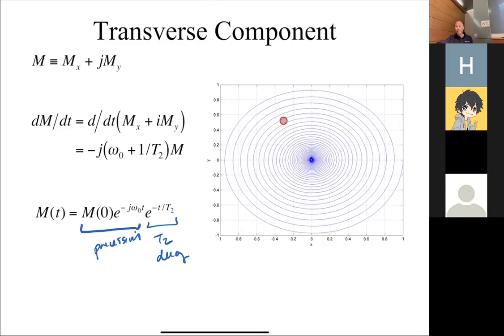Yeah, so when you say precession, that's just the equation representing the movement of that field, right? Yeah, it's basically the Larmor frequency. Yeah, right. So yes.